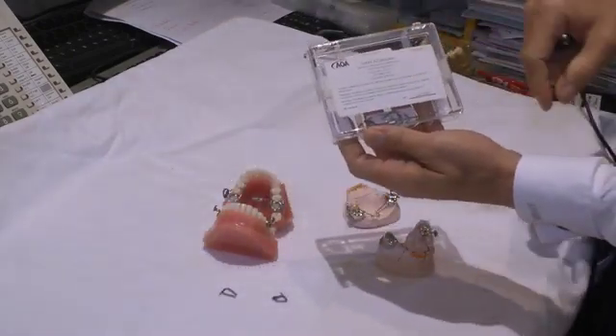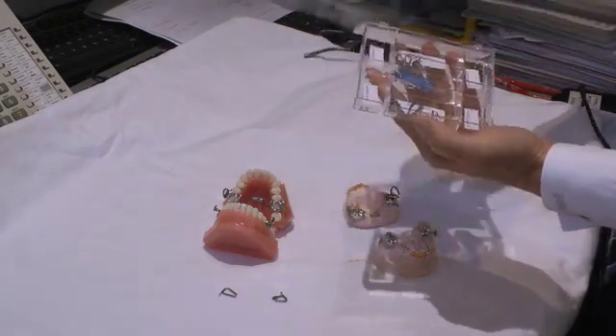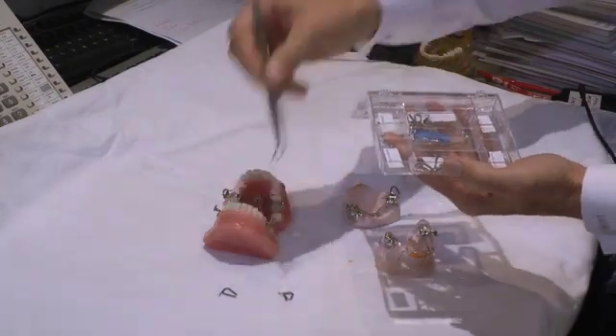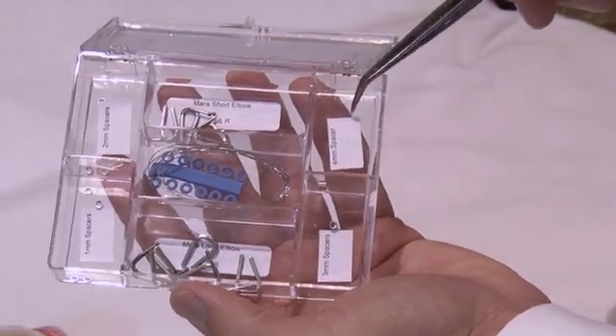Your first MARA will come with a MARA Accessories Kit, which contains some important components. We have spacers used for stepwise advancement. You have a 1mm spacer, 2mm, 3mm, and 4mm spacer.